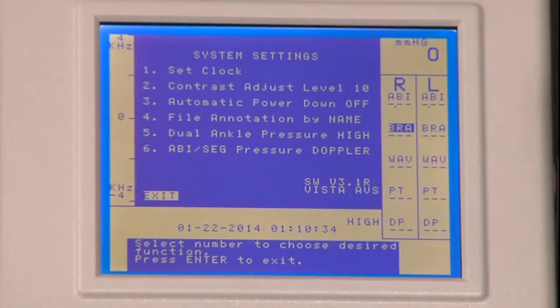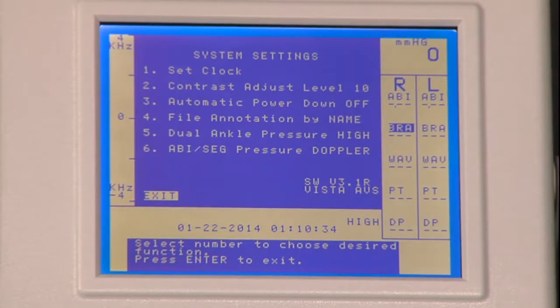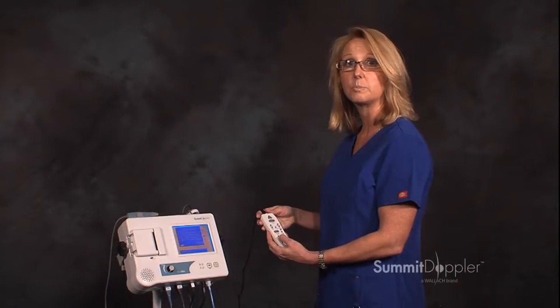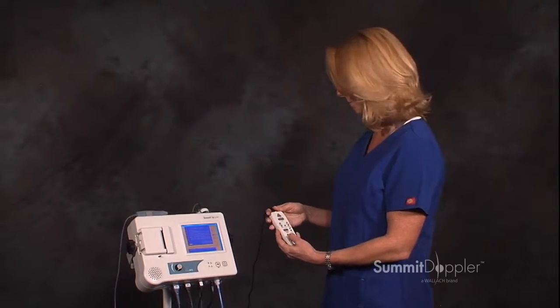Pressing number four for file annotation by name. Pressing number four again changes that option to number. So you can either have your patient information entered by name or number.